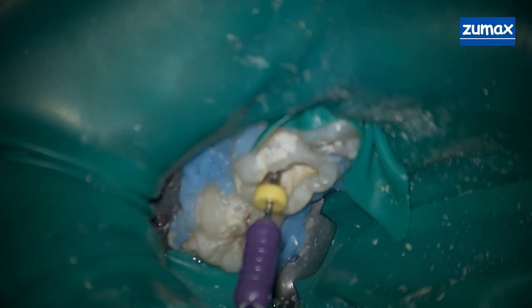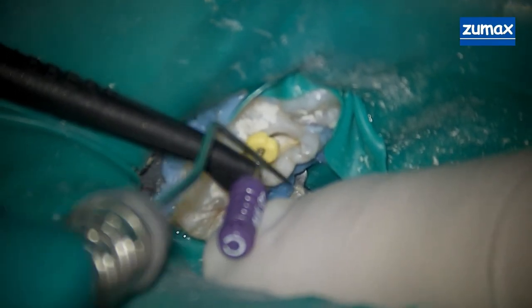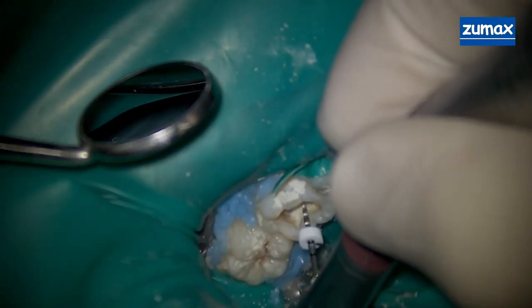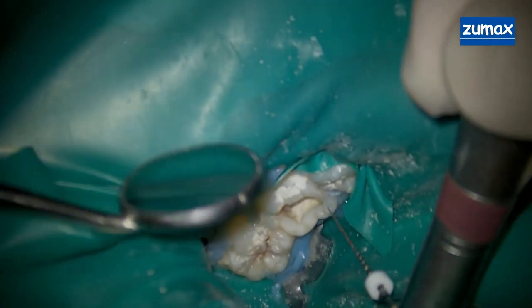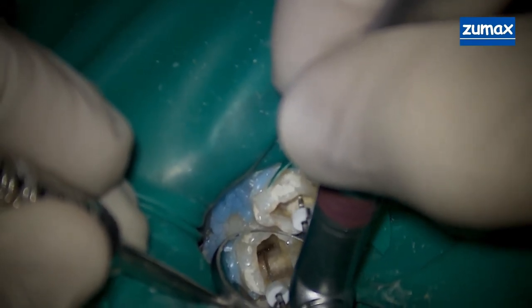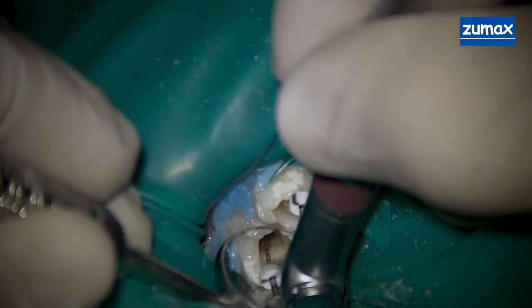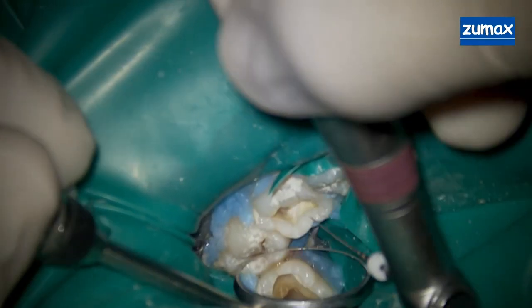At this point we're using a size 10c file into the canals to determine working lengths, using the apex locator to help determine patency. Once we reach patency, we draw back and mark our distance. What you're seeing me use here is a ProGlider to establish the glide path. Generally, to start off — as you will have learned in SimClinic — you use hand files at sizes 10, 15, and 20 to establish your glide path.